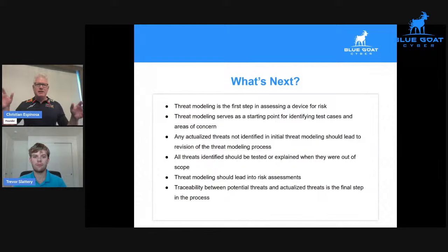And it sounds great in normal traditional cybersecurity, but if this doctor can't get into that device because it's too complicated, then what is the risk to the patient, right? So it's a little bit different lens. And I think a lot of people try to look at it from traditional cybersecurity, like you have to do all this stuff, but we look at it like, what is the actual impact of doing those things? It could have a negative impact. Multi-factor authentication is not always necessary, as an example.